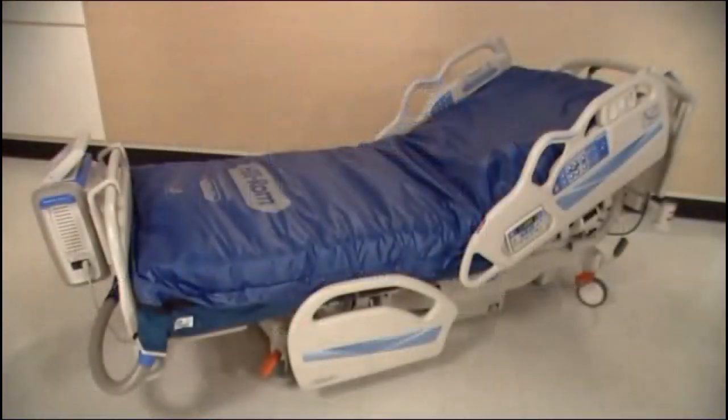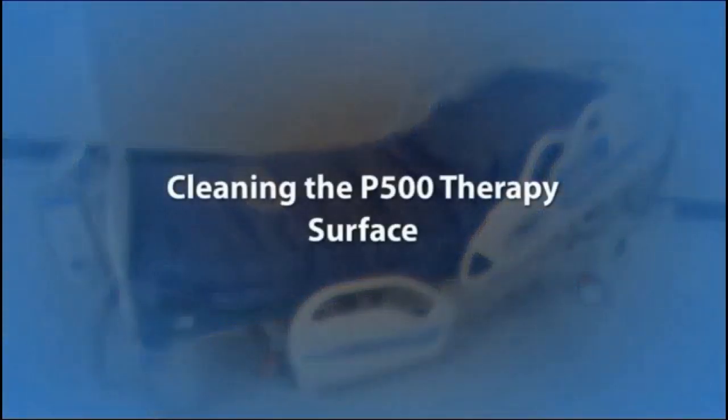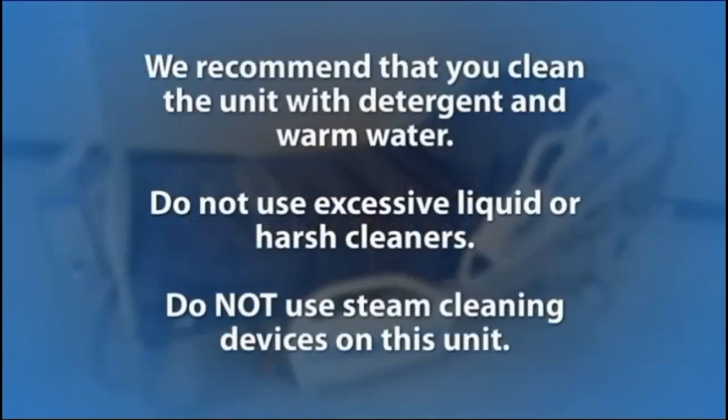Cleaning the P500 Therapy Surface is recommended between patients and at regular intervals during extended stays. Always disinfect Hillrom surfaces thoroughly after each use according to facility and healthcare protocol. We recommend that you clean the unit with detergent and warm water. Do not use excessive liquid or harsh cleaners. Do not use steam cleaning devices on this unit.